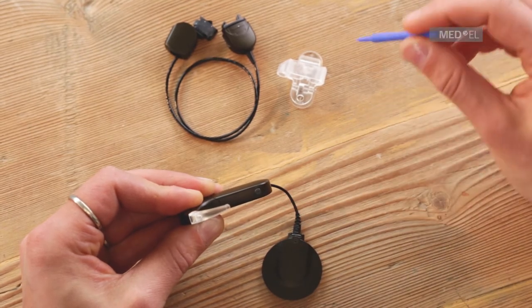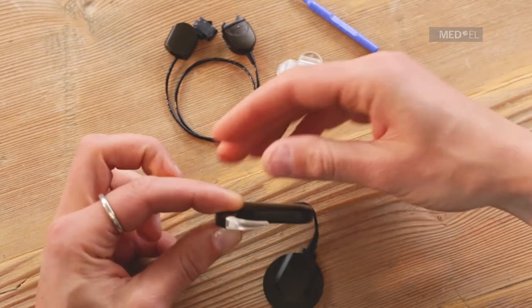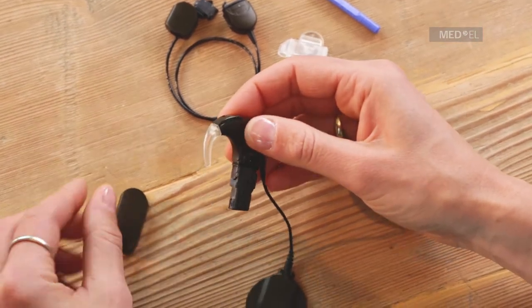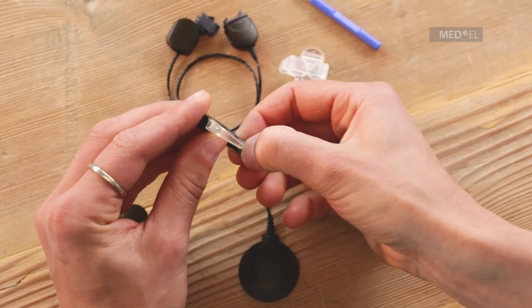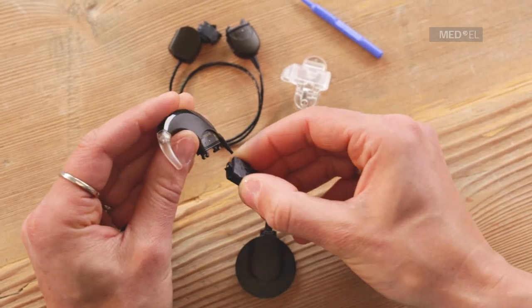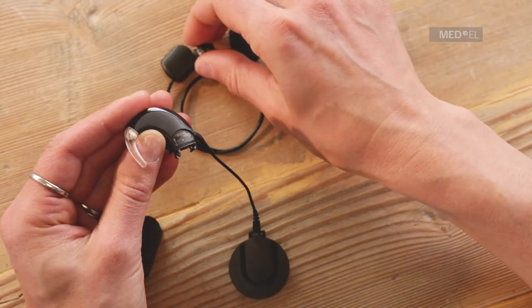Then slide the cover completely off the battery. To remove the rechargeable battery, press the tip of the release lever on the battery and gently detach it from the control unit.